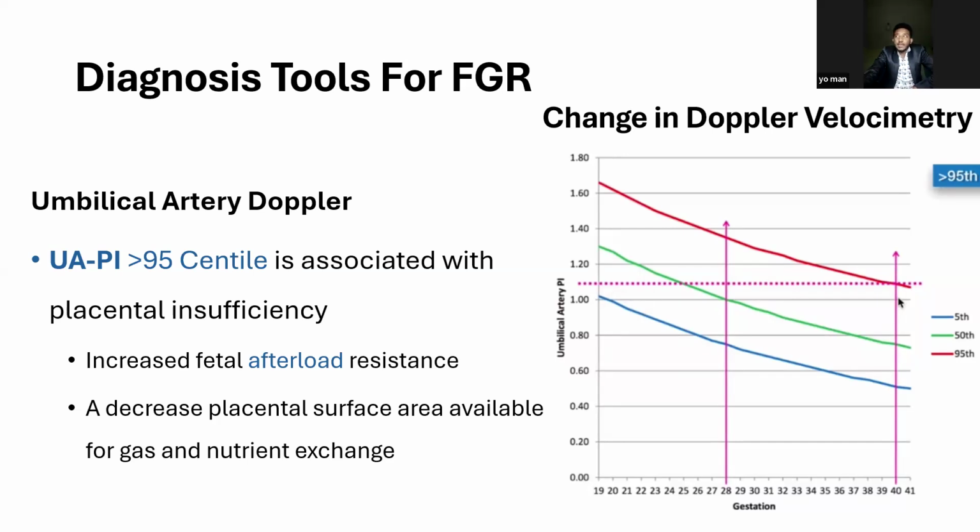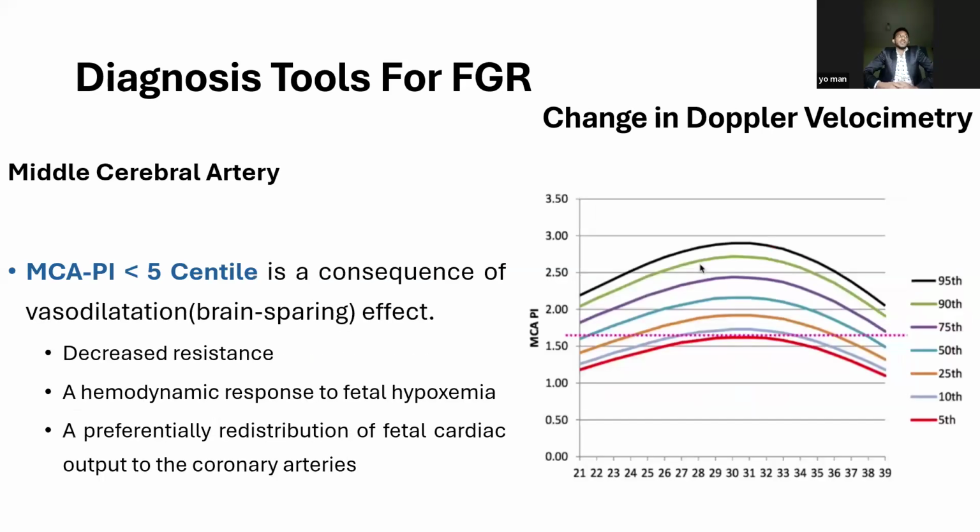But if it is above 1.1, it could also be normal if it's out at the periphery, like beyond here and here. So it's time to check the graph and obtain the exact centile for the specific artery under investigation, okay?